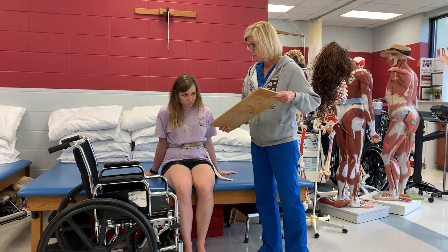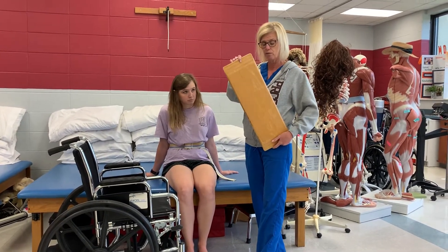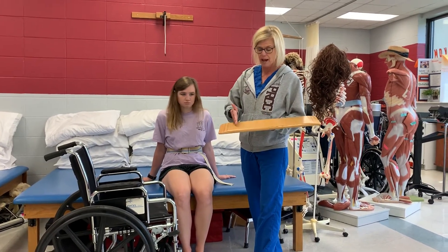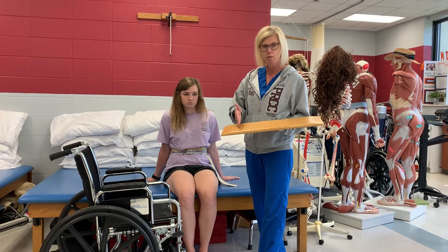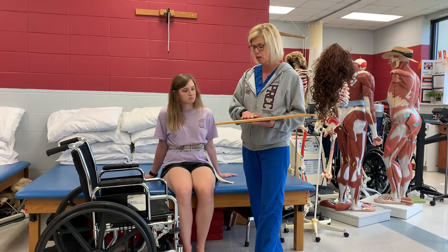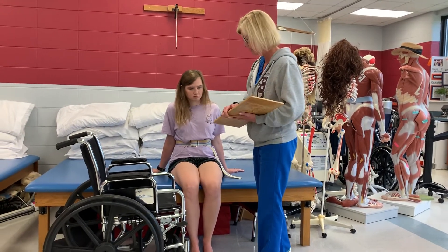What we want to do with this transfer board — this is just a wooden transfer board, but they make plastic transfer boards as well. They also have some that have cutouts on them. Be careful with the cutout — if they put their hand in the cutout when they're doing the transfer, they can pinch their fingers. I prefer not to have the cutout so that they don't even make that mistake.